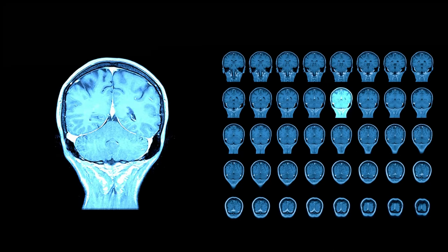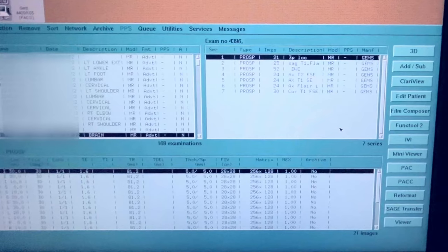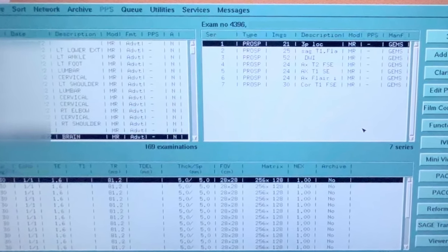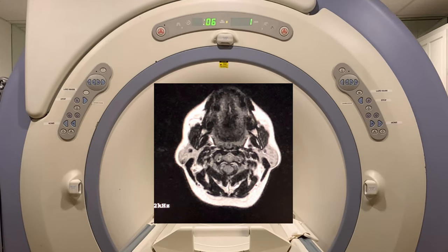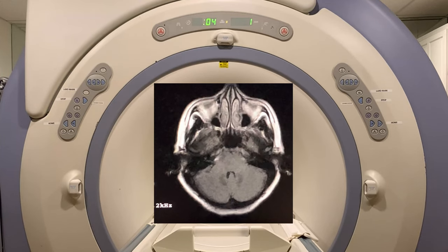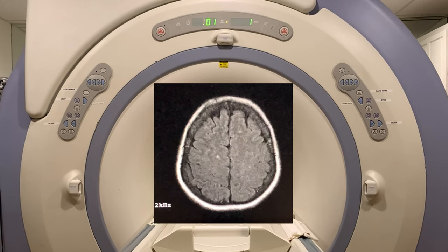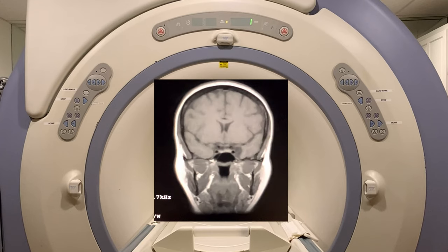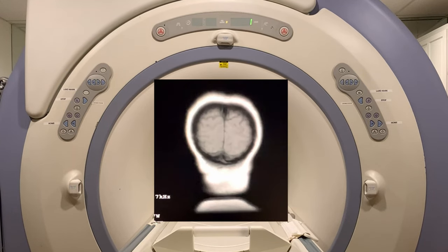Thank you for joining us for another video in our MRI scan sound series. In this video we break down the brain MRI scan protocol to examine the purpose of each pulse sequence. Each pulse series includes a sample of the MRI scan sound accompanied with a brief description and the images produced by each MRI scan sequence. This routine brain MRI scan was performed on a GE Cigna 1.5T MRI scanner.